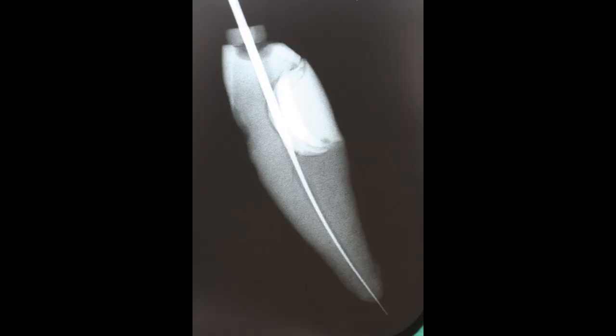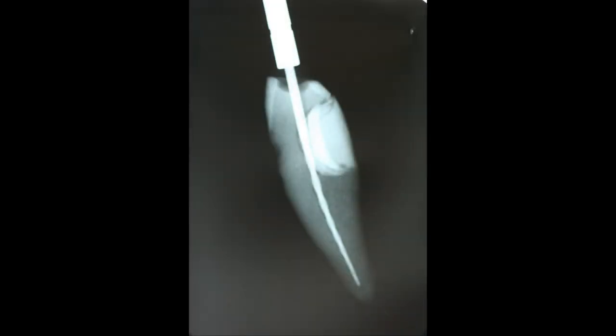Next, I'm going to throw up a couple x-rays and just show you guys how the tooth looks with this file in it, with the Pathfinder file all the way out through there, and then also with the number 40 file at its working length, just so you guys can get an idea.